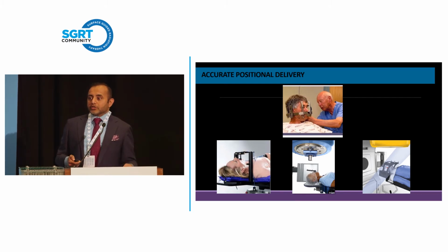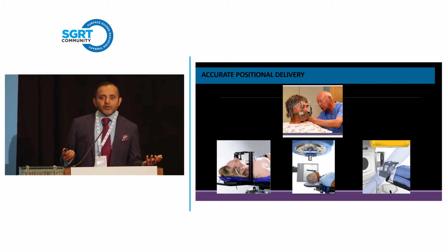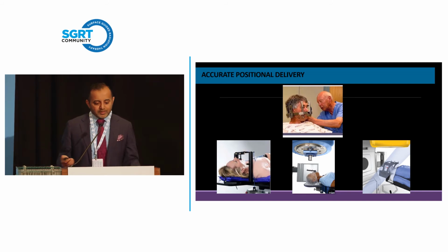We used to do radiosurgery. We used to take a single brain met, and the delivery 5-7 years ago would take on the order of 30 to 45 minutes. Today, we book these appointments in 15-minute time slots, right? We treat a single isocenter, literally within 15 minutes. If we were doing multiple isocenters, we give them a 20-minute time slot, and we never reach our 20 minutes.